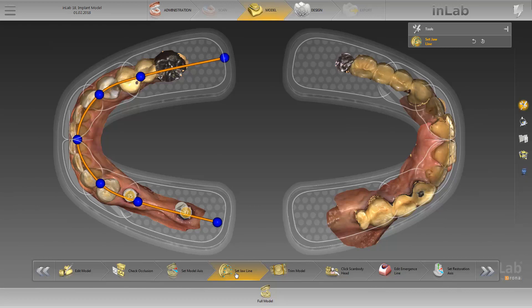Here we adjust the jawline using the blue dots. Once the tooth numbers are placed on the positions of the implants, the in-lab software will calculate the position automatically, and we can continue with the next step, which is click scan body head.